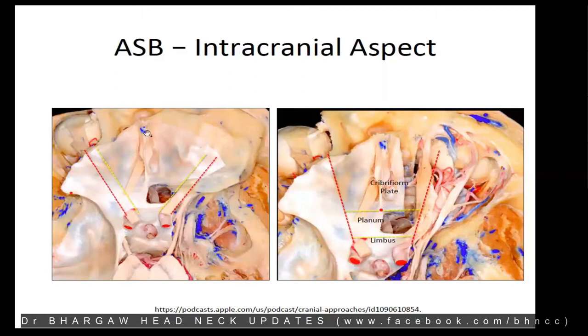So when we're beginning with doing an endoscopic craniofacial resection for any malignancy, we should start off with any pathology located in this area, and then you may, as you gain experience, go till the red line. But that would not be ideal, that should not be your first case to begin with. So these are the structures that you need to know.